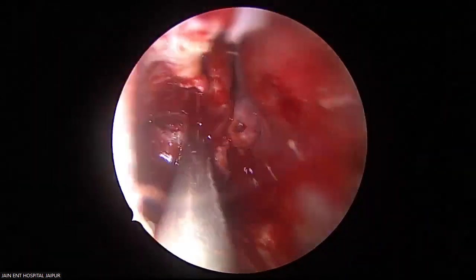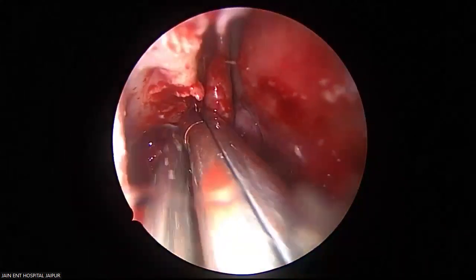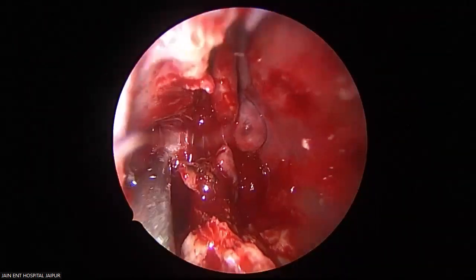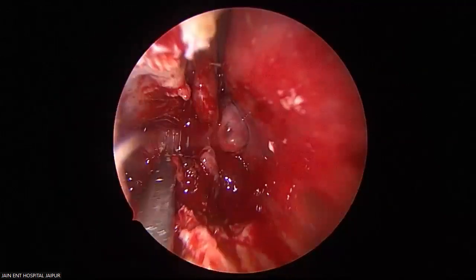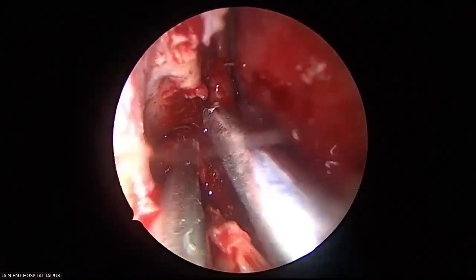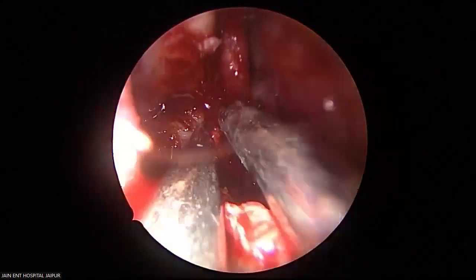That was the uncinate process I removed. Could you see? Behind the nasolacrimal is the uncinate process. See this? Now, debrider. See what we are getting is this exposure, head-on exposure to the posterior wall of the maxilla. Could you see very clear or not? Yes, very clearly.